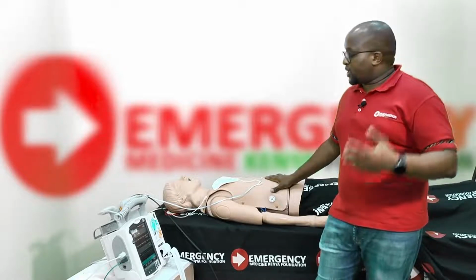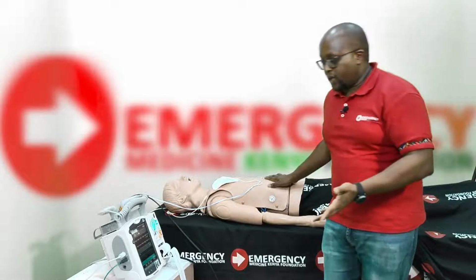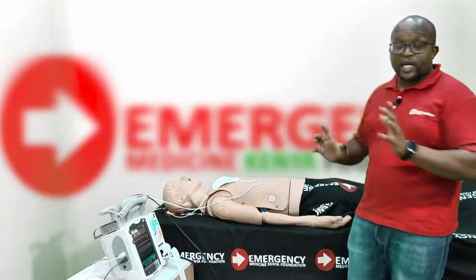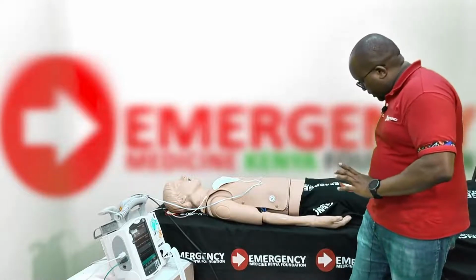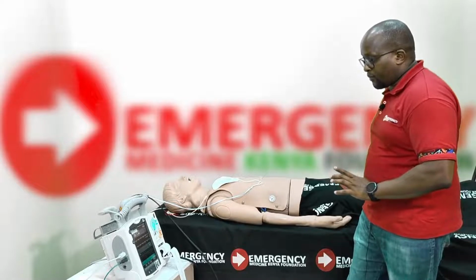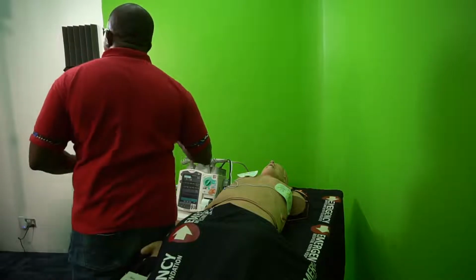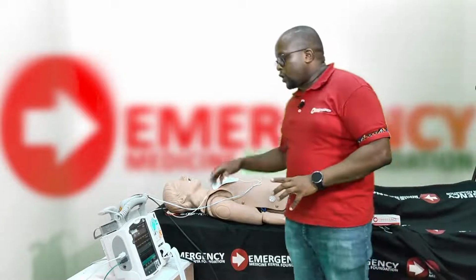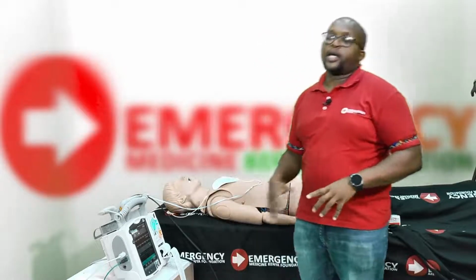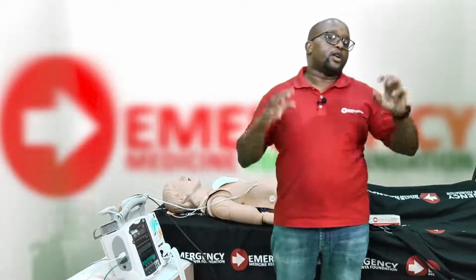In demand mode, if the patient's heart rate automatically improves and maybe becomes 75, then the machine will go into a standby mode. I'll try to artificially increase my patient's heart rate, and you should be able to see on the screen what happens. I don't know that I'll be able to simulate this, but if the patient's heart rate goes above what you've set, the machine will go into a standby mode.